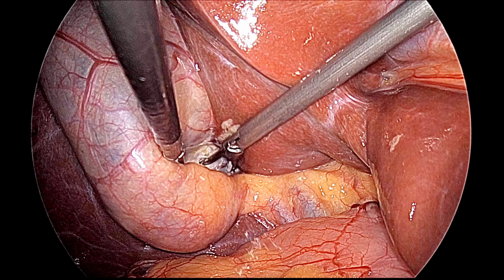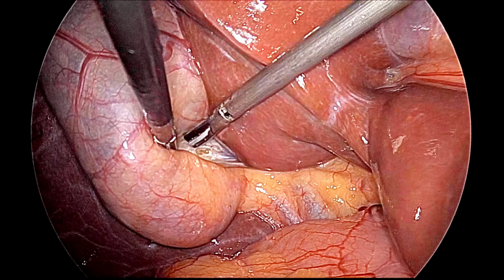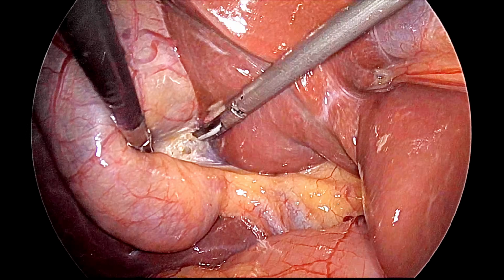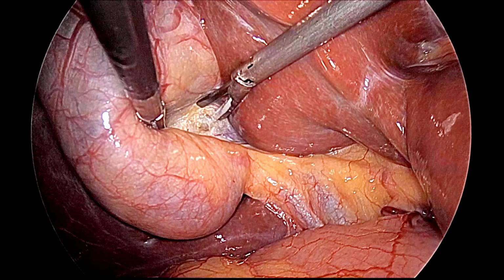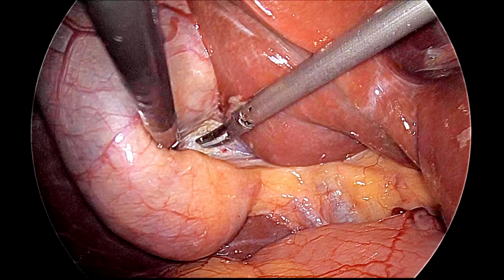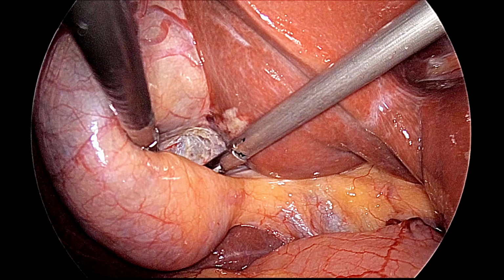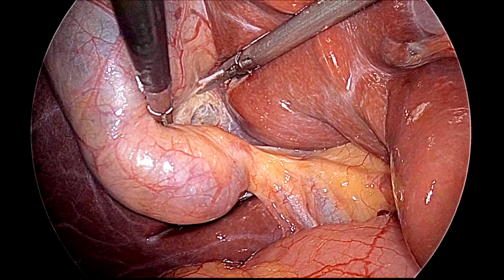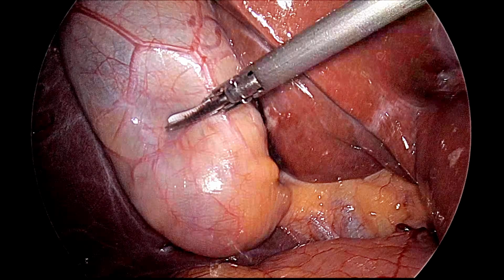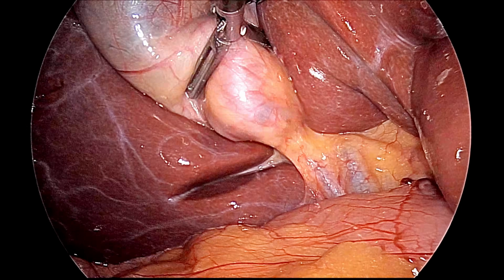So, you should try to remain in a visible area, and this is slowly enlarging the anterior peritoneum dissection, which is being carried out. So, it is a combination of blunt dissection, and if the peritoneum comes in the way, then only you can use the energy. And this is the anterior dissection is over.